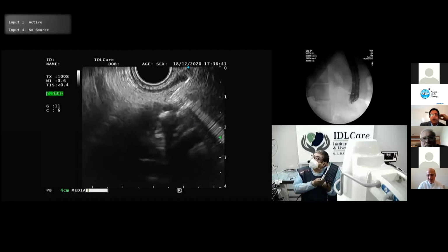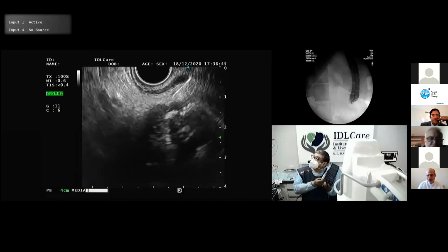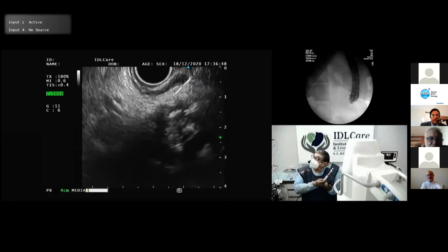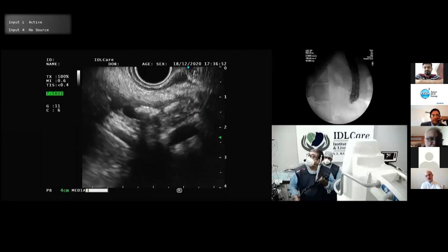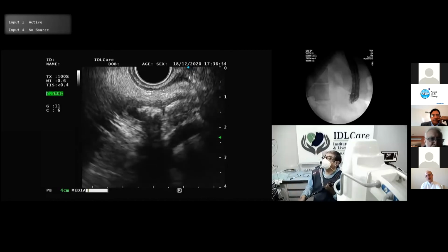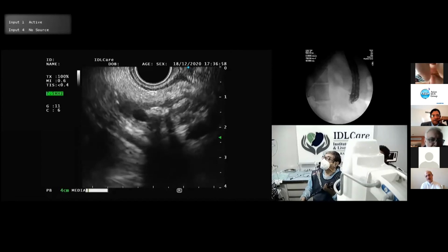No. Yeah, the structure is very tight, so the Spyglass is not going to help us there. Now, if we can puncture this thick wall here, almost, see that looks pretty good.